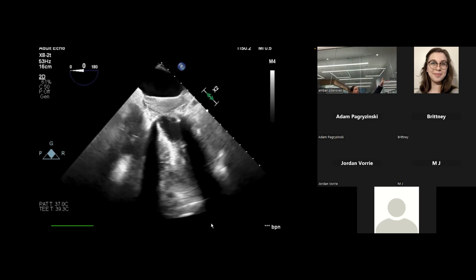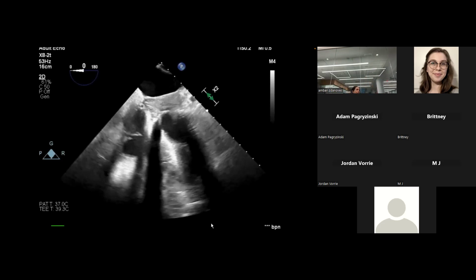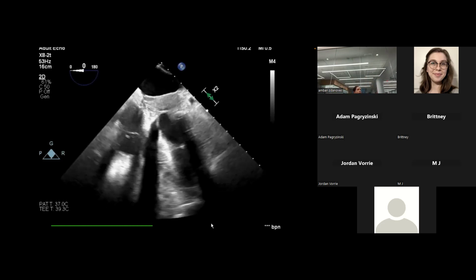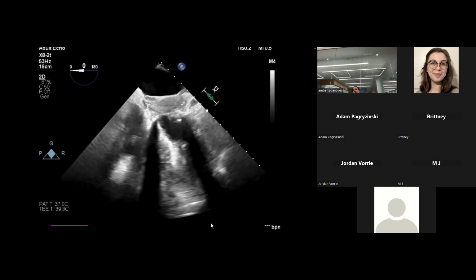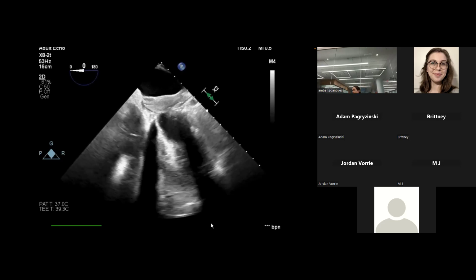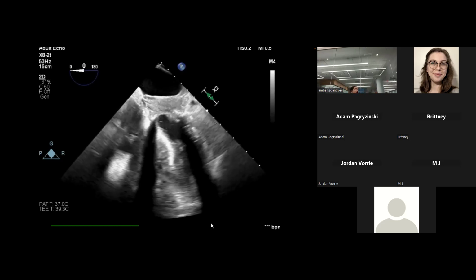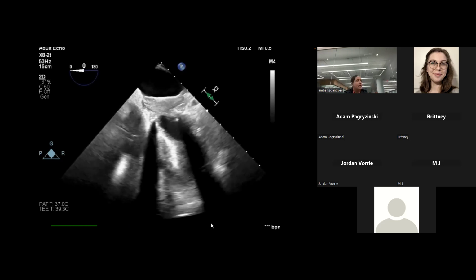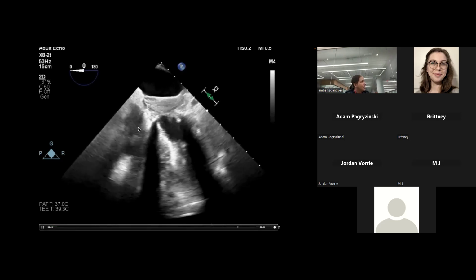All right, so we're at 0 degrees. So what view are we more than likely attempting to get here? Four-chamber, okay. Do we see anything? And remember, someone who's had valve replacements is also tricky because they're going to have all that dropout artifact. Do we see anything that looks like something we could identify anatomically? Yeah, a hint of a valve. Both sides have a little. Okay, tricuspid.